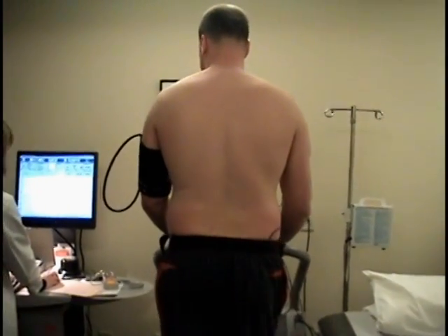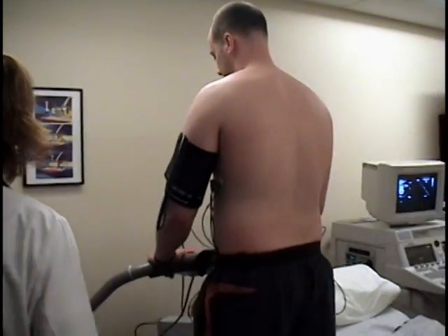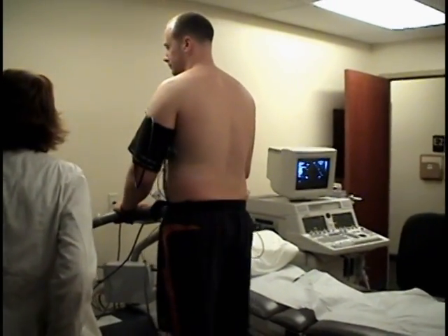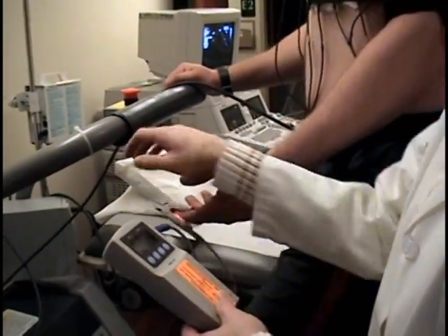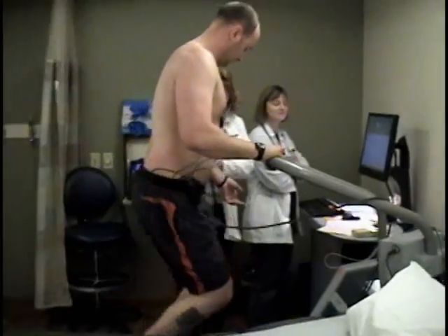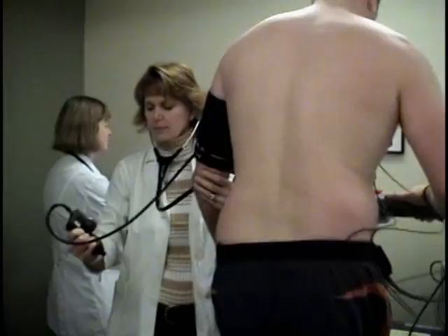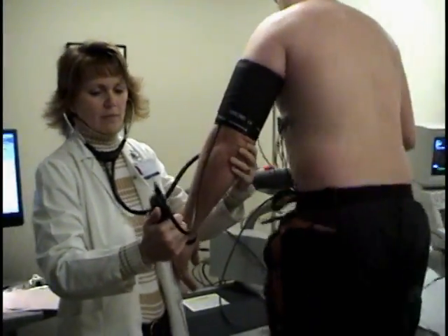The treadmill will increase in elevation and speed as the test progresses. Our nurse and sonographer will monitor your vitals throughout the test. If at any point you feel that you cannot go any further, have chest pain, shortness of breath, or are feeling dizzy or nauseous, please notify our staff immediately. Otherwise, our staff will allow you to exercise until you reach your target heart rate.